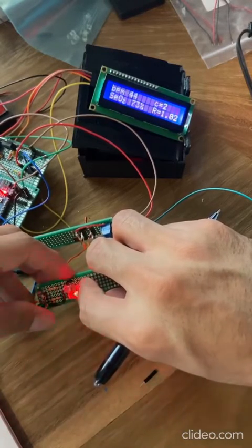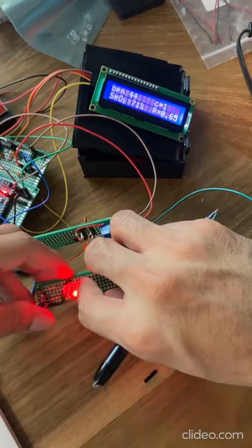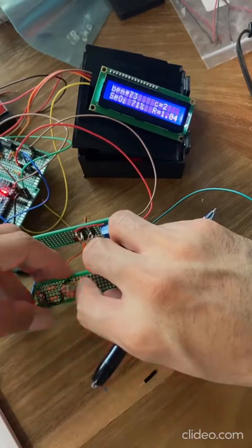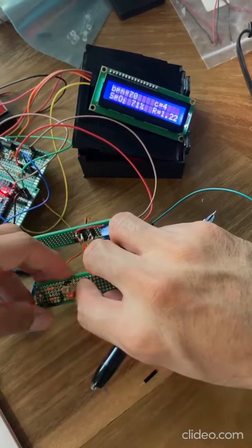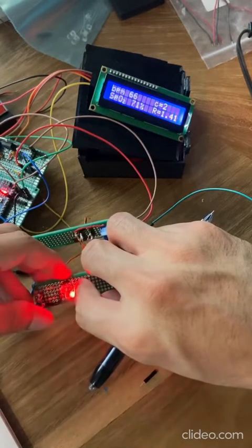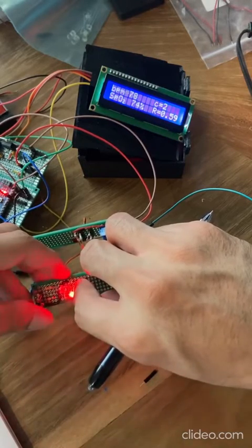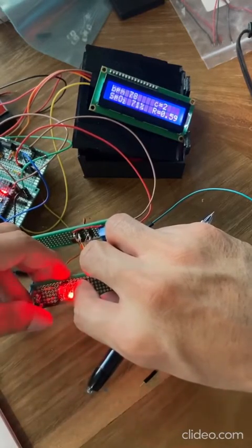As soon as there's enough averages to be taken, it'll take a heartbeat. And it says I'm at 44 beats per minute and 71% oxygen. It's kind of sort of accurate. It's kind of working. We got lucky right now. So this is what it's supposed to be doing. I might be at 85, maybe. But yeah, there you go.